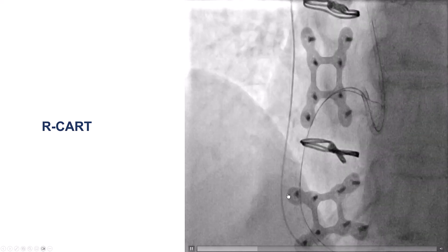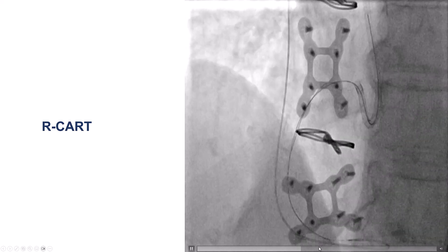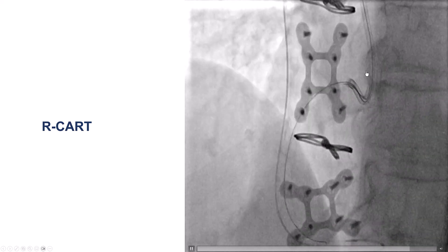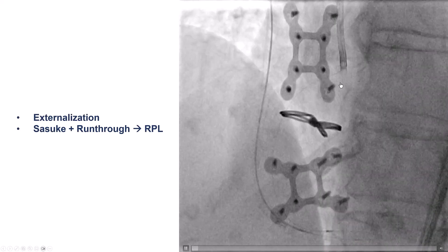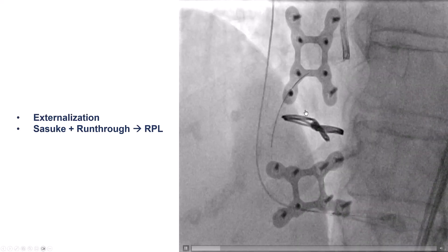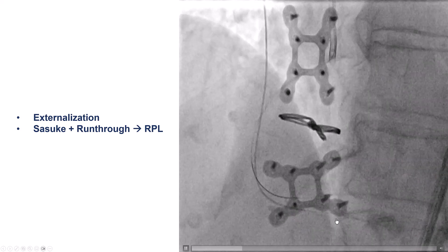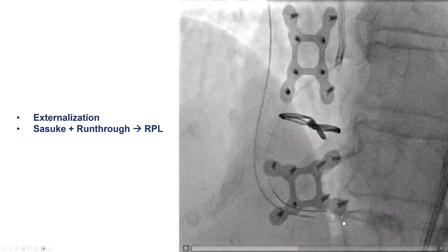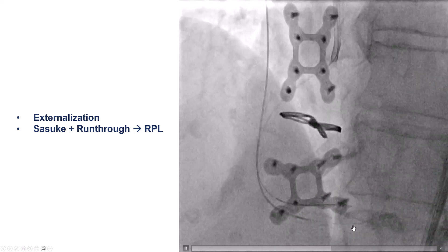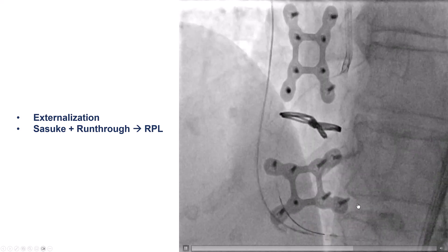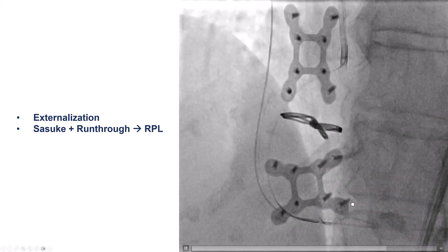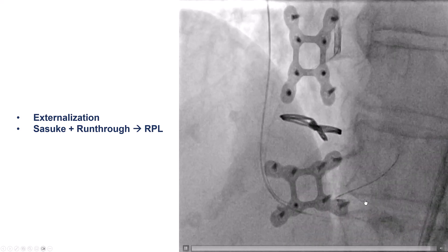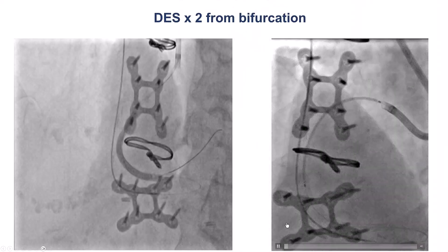We did a reverse CART with a balloon distally, and then we were able to advance the retrograde guide wire inside the antegrade Amplatz 1 guide catheter, externalized with an R350. Given the bifurcation, we advanced the dual-lumen microcatheter — a Sasuke — close to the PDA-PLV bifurcation, and then used a workhorse guide wire Run-Through to wire into the right posterolateral. This is very important before stenting, to have access to the vessel in case it becomes occluded.